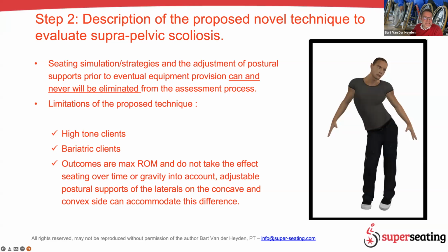There's a limitation also for the technique for high tone clients, bariatric clients, and I also think that the outcomes will need to be adjusted for gravity. The technique will collect data in a supine position, and the data you get from width and height buildup on the ischials will be accurate.